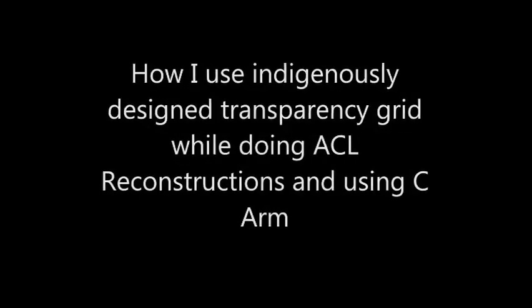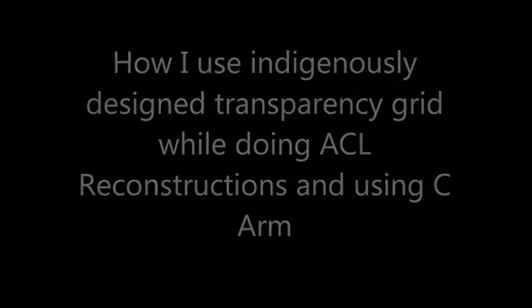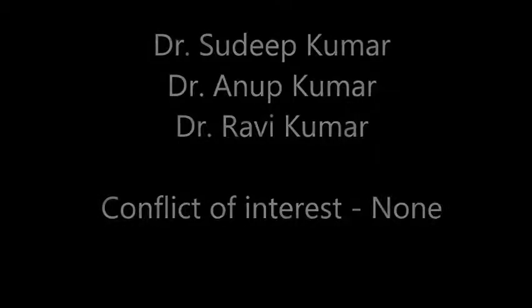How I use my indigenously designed transparency grid while doing ACL reconstruction and using C-arm. Authors report no conflict of interest.